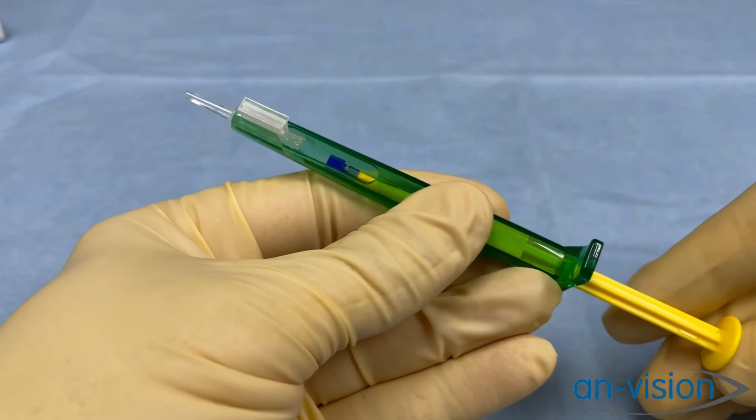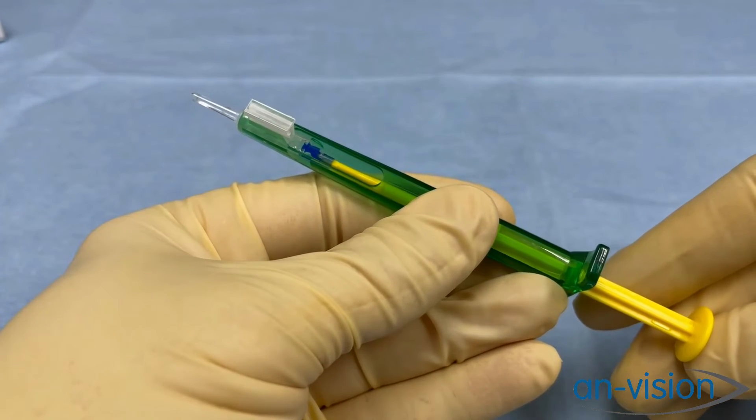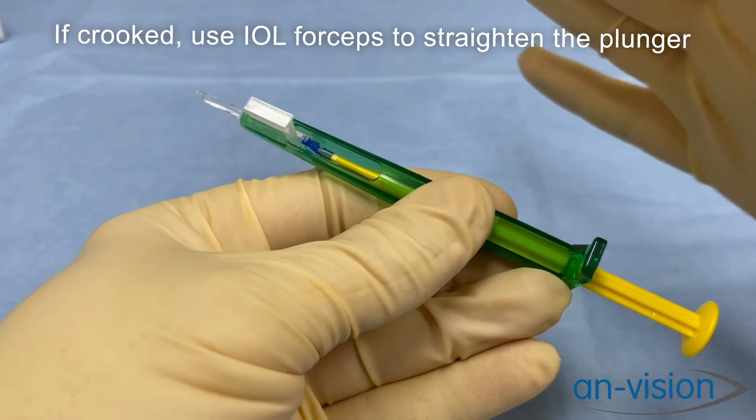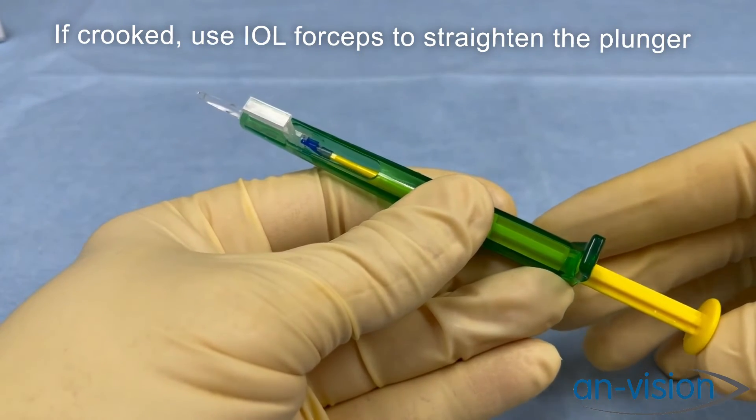As we push this plunger into the loading chamber, we want to make sure that goes in straight. Sometimes it can be angled, but if it goes in straight, there is less chance for it to catch a haptic of the IOL.